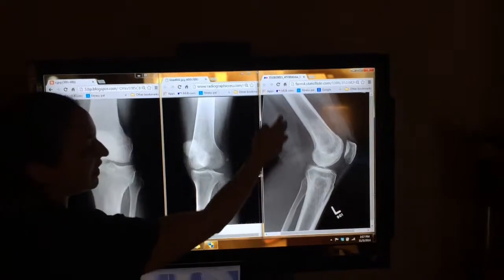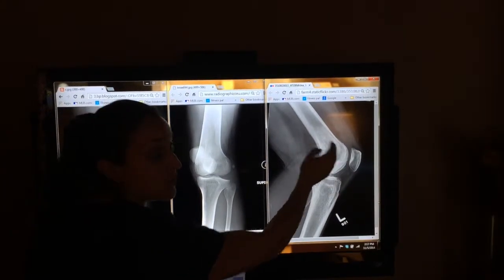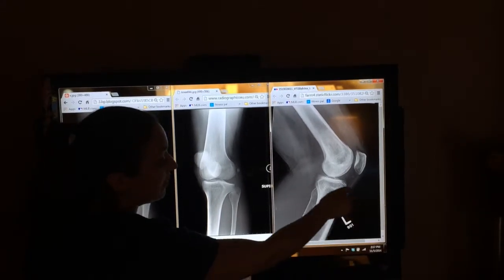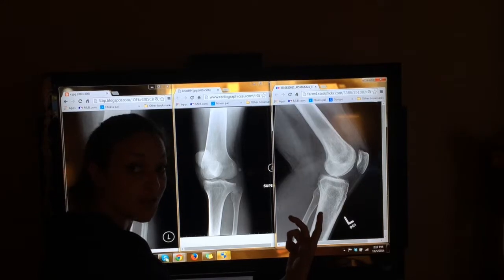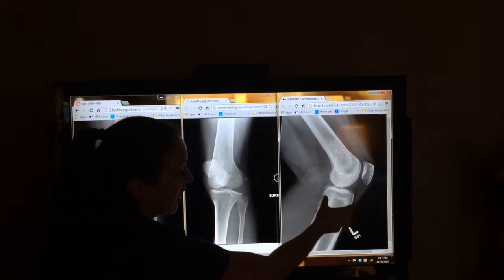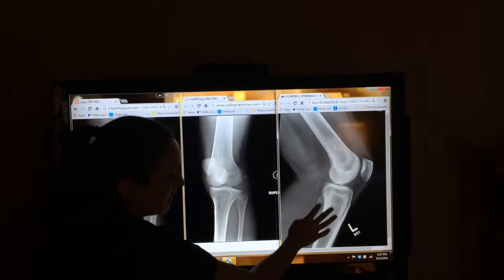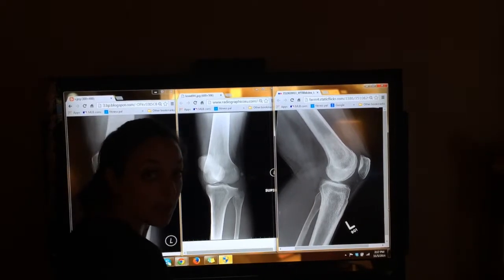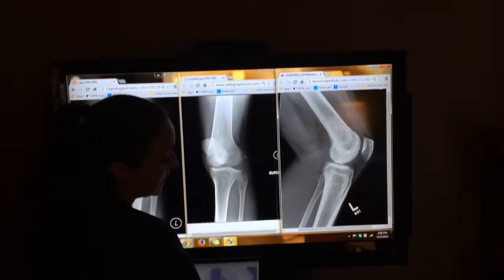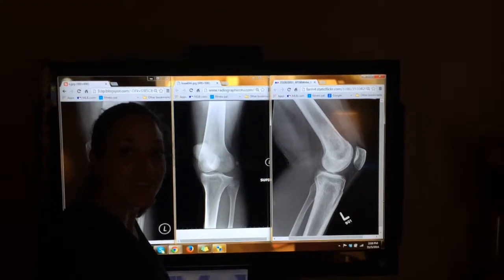For the next view, the leg is bent at a 20 to 30 degree angle. The joint space between the patellofemoral joint is open. This is a great view of that. The epicondyles are superimposed on one another, and there is joint space present, which looks great. This leg is also straight because the fibula just slightly superimposes at the proximal joint from the posterior part of the tibia, so that looks great as well. And my marker's on there, so this looks like three great films.